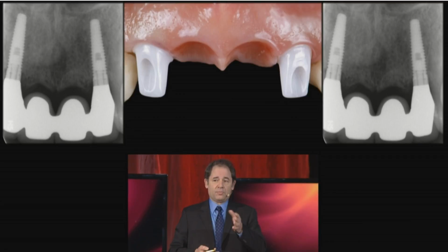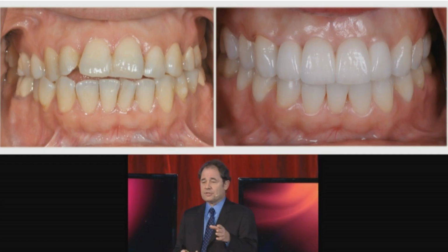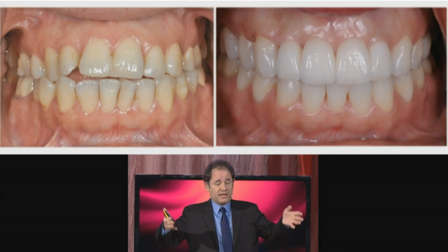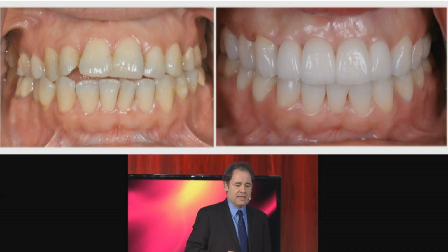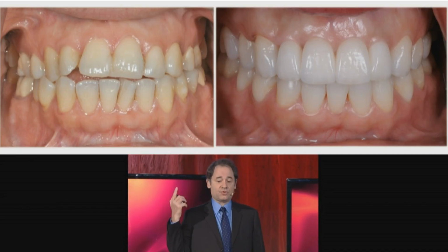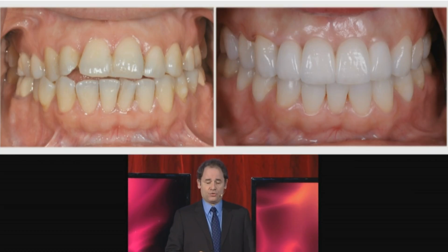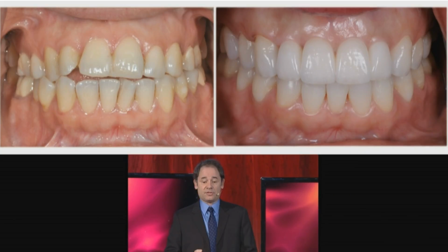So we're going to try to marry here a little bit of sparkling with a little bit of natural for the patient. The central incisors have a little bit brighter value, laterals a hair lower value, canines lower value. We learned that from Willie Geller in the 70s. And vertically speaking, there was no augmentation. There was no bone augmentation. There was no connective tissue grafting. And it was flapless surgery. The patient is missing bicuspids. In the maxilla, you only have one bicuspid on either side.